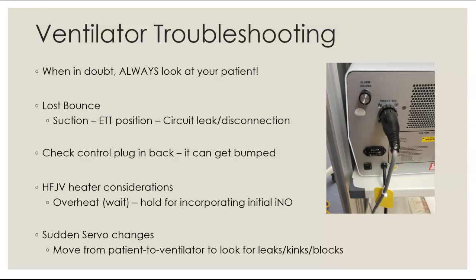Sudden servo changes. If we're trying to figure out what these sudden servo changes are, again, move from the patient to the ventilator, check for leaks, kinks, and blocks. On the circuit, there's a lot that could get pinched, that could get removed, that could fall off. Sometimes just something will be in a weird position. So try to figure out what on your servo pressure is having issues.